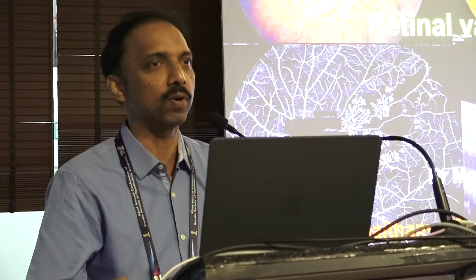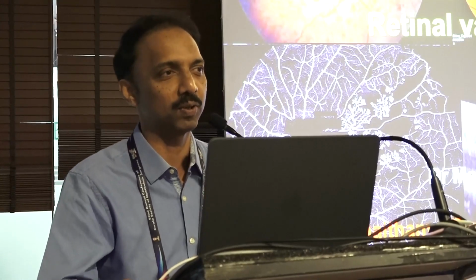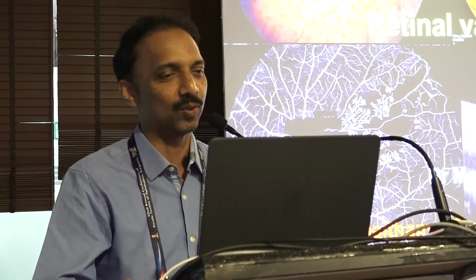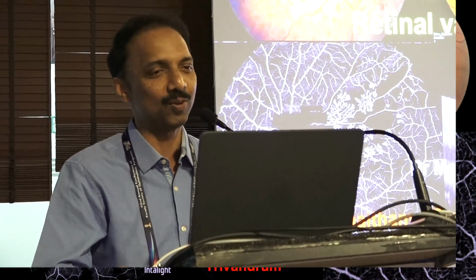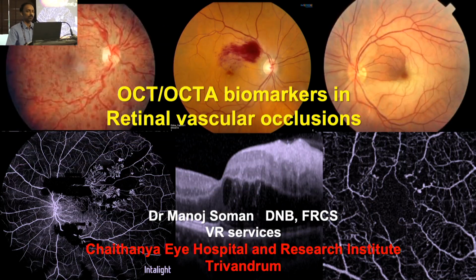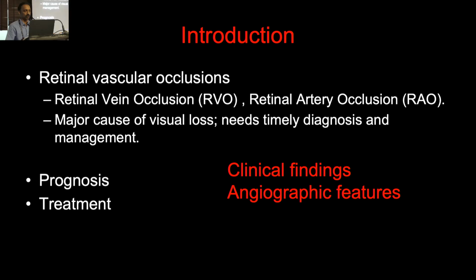Of newer nomenclature. Now, as retina specialists, we are very fond of newer acronyms. So continuing with that trend, I'm going to introduce you to some more terms in this talk. Anyway, my talk is on OCT and OCTA biomarkers in retinal vascular occlusions.